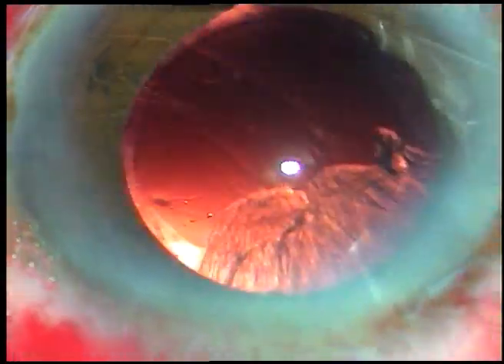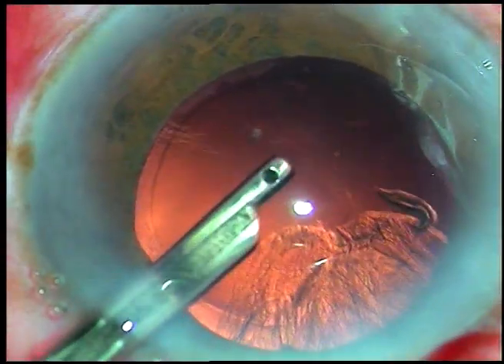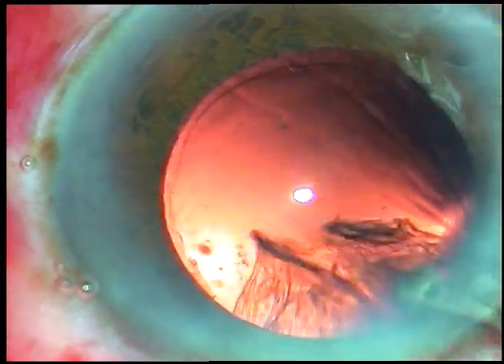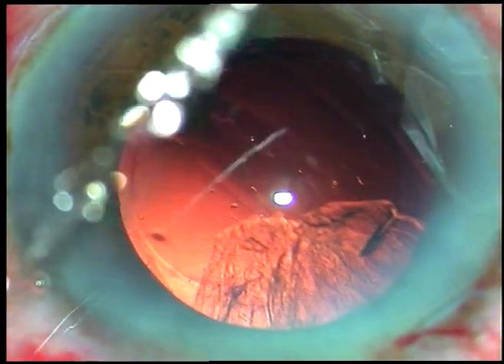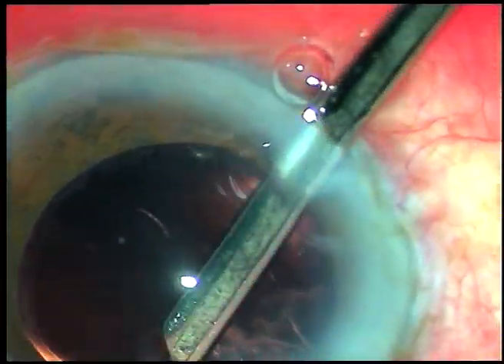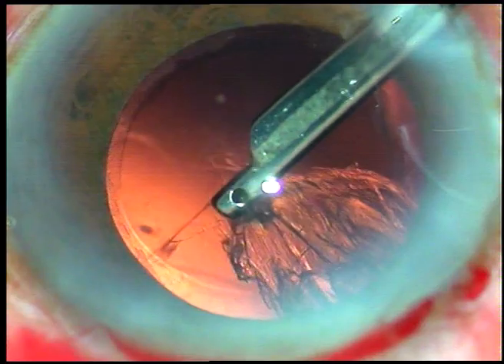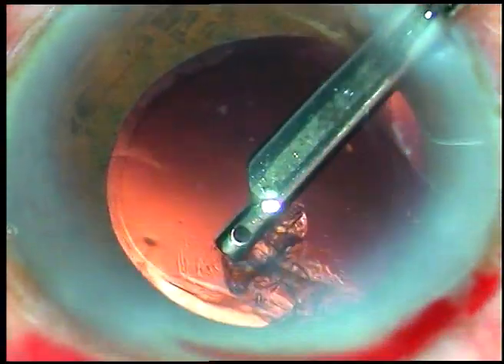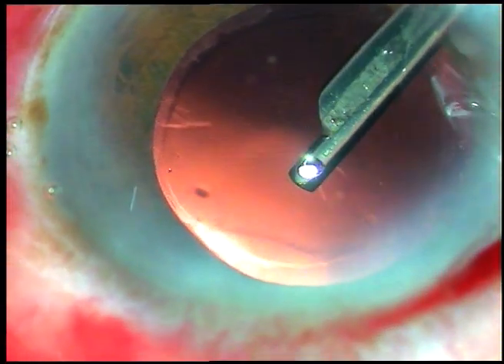More than half of the cortical matter has been removed. Now I go through the side port and remove the cortex from the sub-incisional area. Here I am removing some epinuclear or nuclear material so that it doesn't get lost somewhere under the iris. Now through the right side port I am removing the sub-incisional cortical matter.